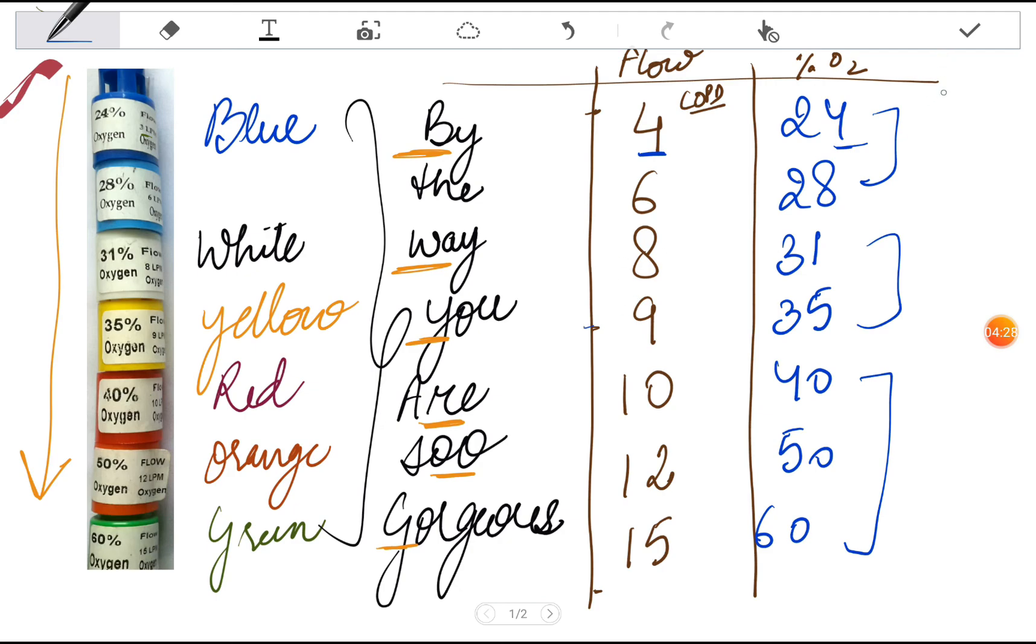These ones are not really important. Main ones are blue and the green ones, which are basically used in the hospitals.